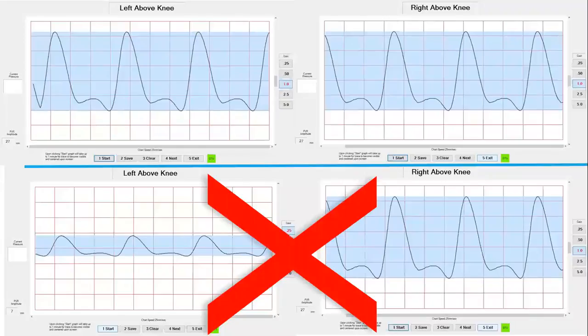When the study has been completed and the gains are identical for the twin cuffs, you may sign and send the test.